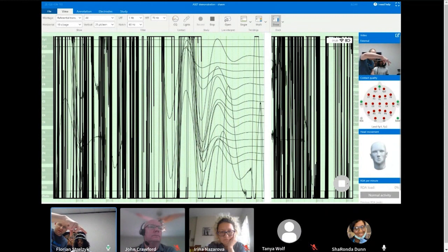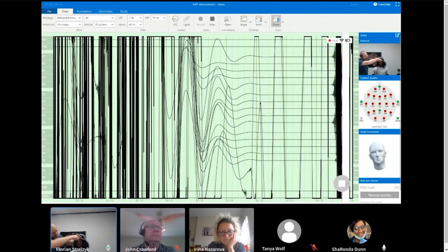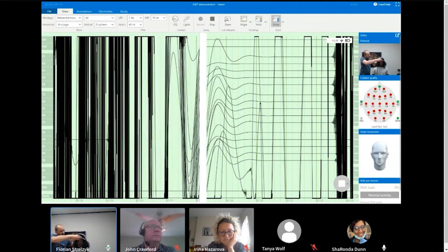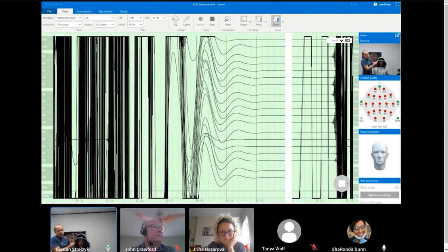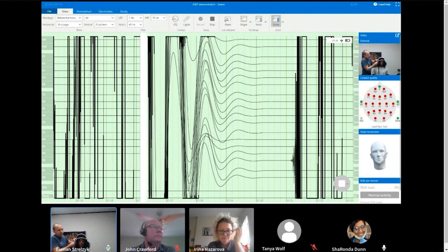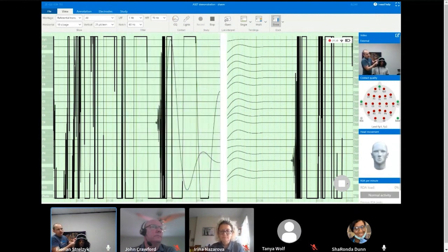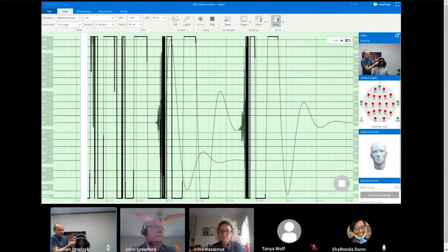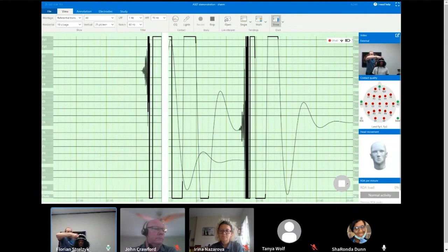So what I'm doing, which is maybe a little bit different from a setup with straight hair, I want to make sure that the electrodes are placed nicely. So we have these three legs. I don't want any of these legs to be bent under weirdly. So I just made sure that all of these are placed well before I'm engaging the headbands. So now I'm tightening the band a little bit. And as I'm doing this, I want to make sure that the electrode legs are touching the scalp. So I'm literally taking my fingers and I'm manipulating these legs to get through the hair. Think of it like little Q-tips that you kind of wobble through the hair until it touches the scalp.